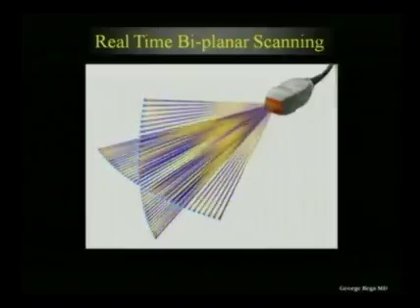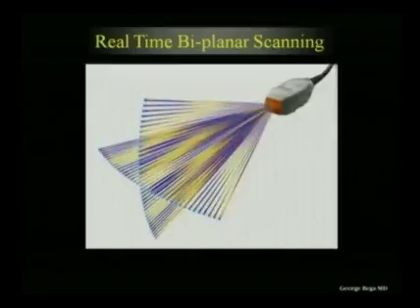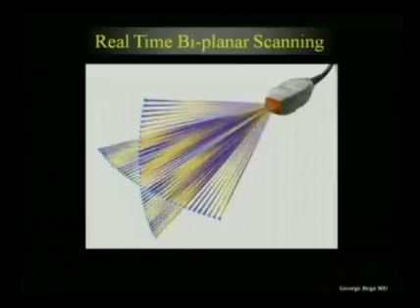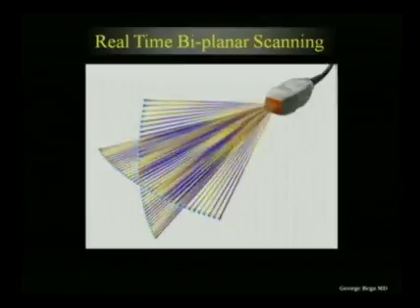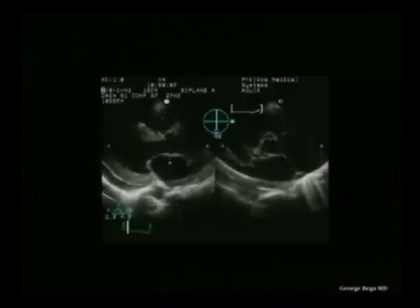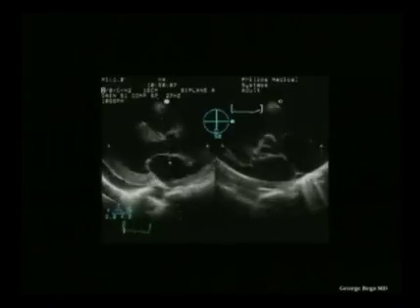Now, as I mentioned before, these transducers can have biplanar real-time scanning that is real-time, and they are focused all over. This is, again, the future of 3D ultrasound, because now we're not going to necessarily have to scan with one beam. We'll scan with more than one beam. We'll generate at least biplanar displays, although more image planes are possible.